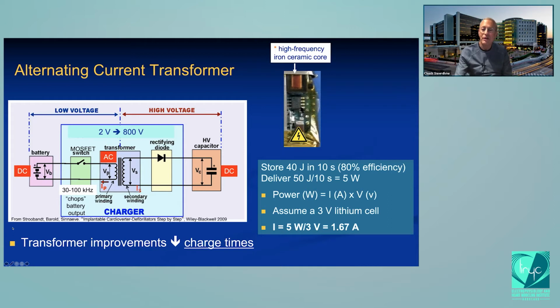That little block that, when you connect your laptop to the wall, that's the reverse type of transformer. The current comes out of the wall in Europe at 220 volts. Your laptop operates at 9 volts or 6 volts, and so you want to step down the voltage. And of course, there are inefficiencies there, and that's why your transformer can get hot.